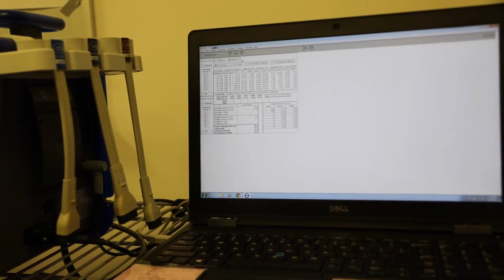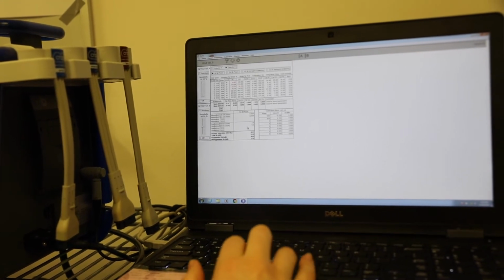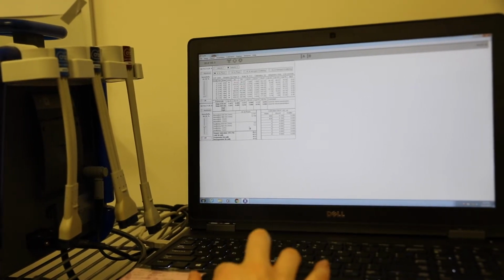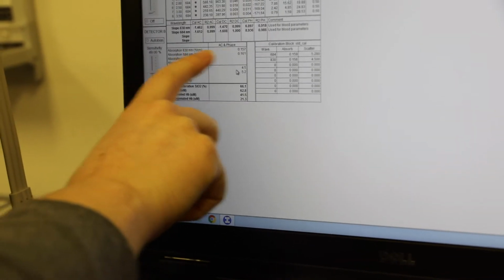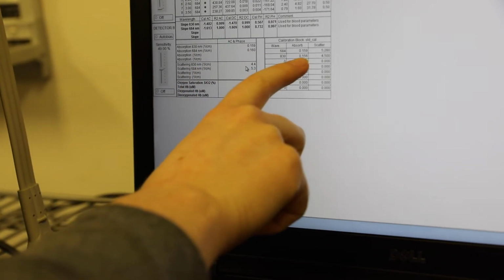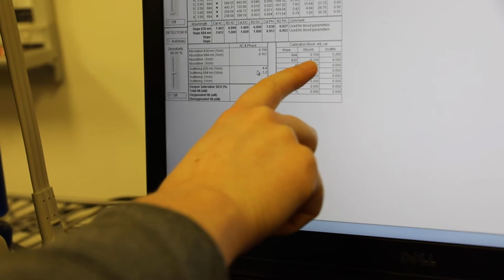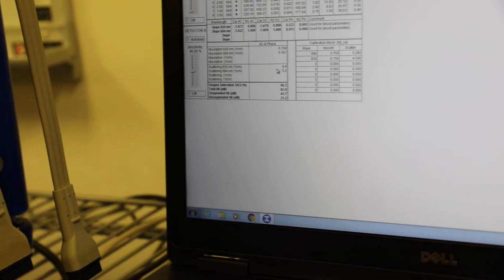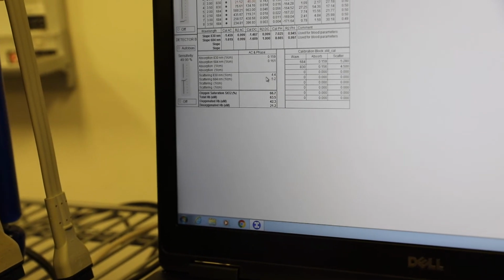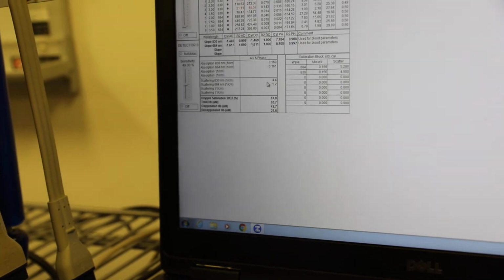Once it's complete, that window will go away and we're back to this regular screen. So to check that it calibrated correctly, we want to check these numbers right here and right here. We want to check that this absorption for 830 should match the number that's right here. So 0.156 for absorption for 830, that should be about the same. So it's measuring at 0.158 or 0.159, which is really close to the 0.156. So that should be good.